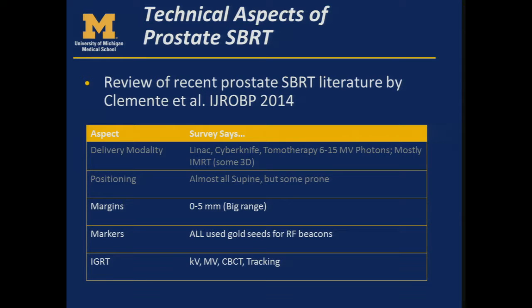And things were all over the place. So delivery modality, what sites are doing, it's a combination of Linac, CyberKnife, tomotherapy, 6 to 15 MV photons only. There were no proton studies here. And most sites were doing IMRT. I think there was one or two using 3D planning. And I think that is pretty typical when we consider most sites are also using IMRT or VMAT for conventional prostate radiation therapy as well.